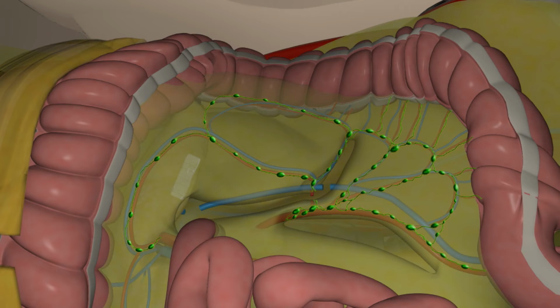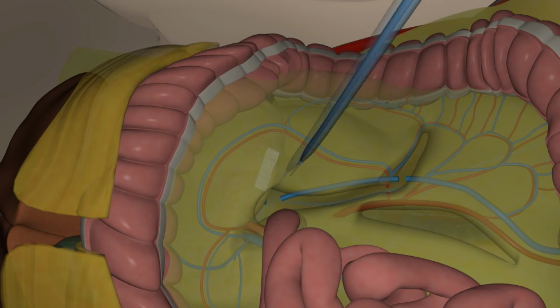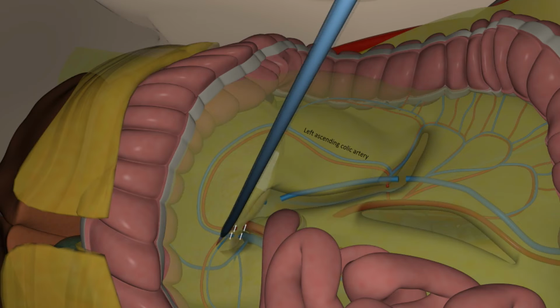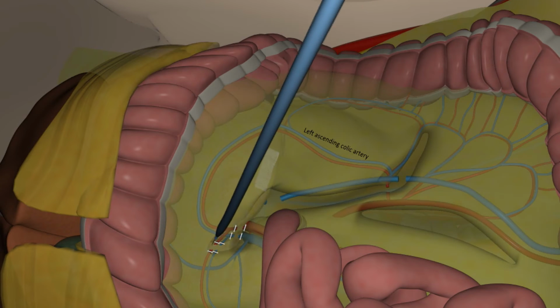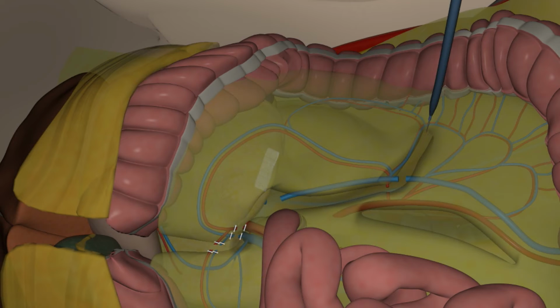Traction is applied to both flexures, and this allows us to find the root of the middle colic vessels. The visceral peritoneum covering these vessels is opened. Then the middle colic artery and the middle colic vein are dissected and clipped. Then the proximal and distal resection margins are transected at least 10 to 15 cm away from the edge of the tumor on both sides.